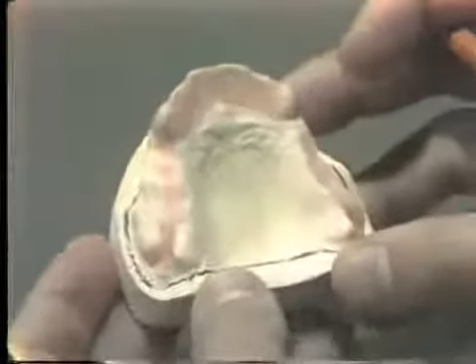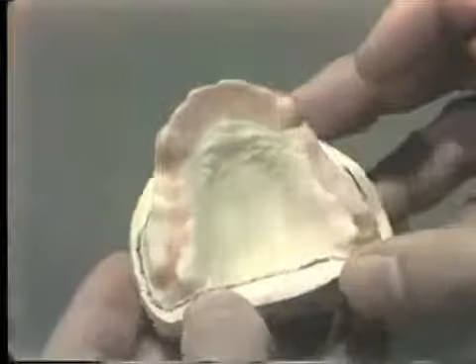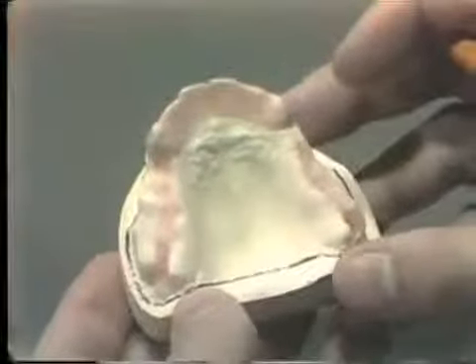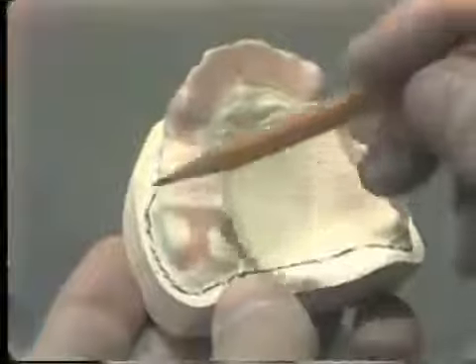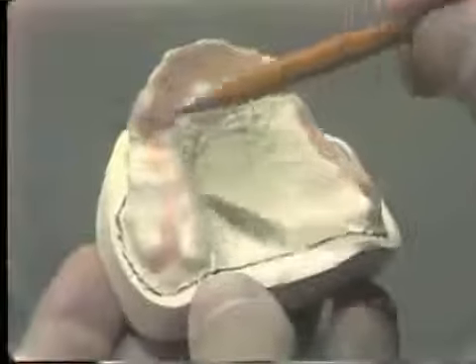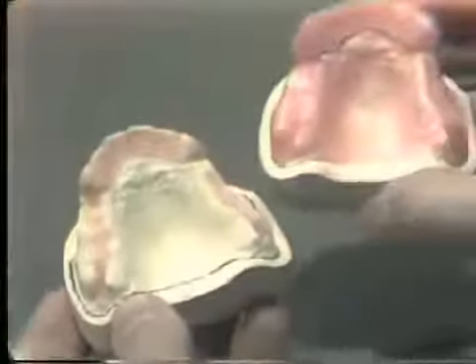In this sectional tray technique, we are going to be making 2 trays that fit together as one for securing the final impression. The first tray will cover the posterior border of this arch, covering all of the edentulous area, the ridges bilaterally, the palate, up to the lingual surfaces of the teeth. And this tray will be made exactly as the trays that you are familiar making for a completely edentulous mouth.